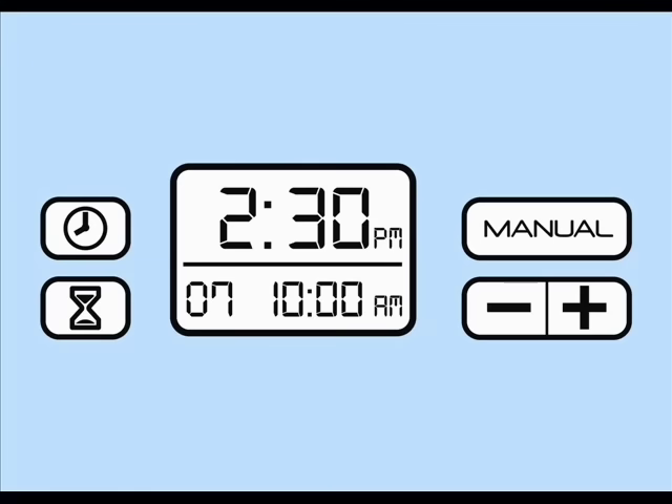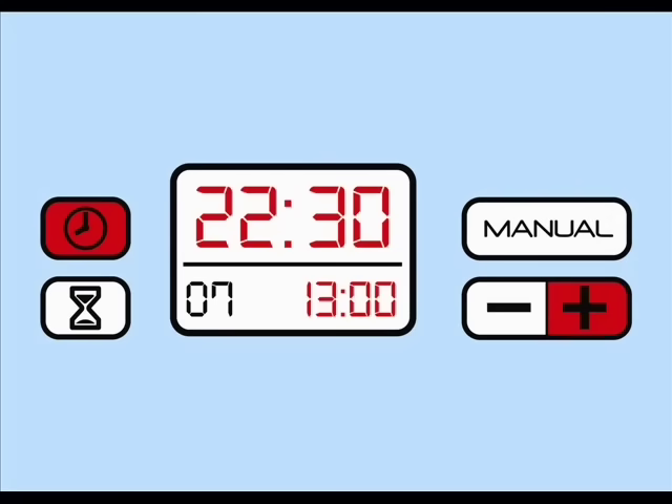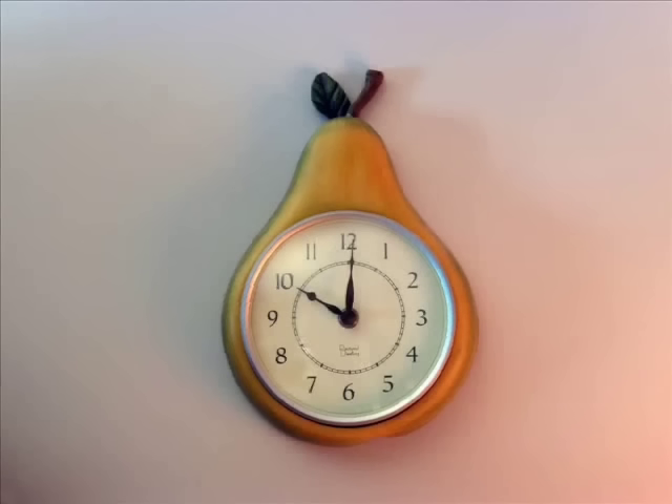If you prefer your clock to display in the 24-hour military time format, press the plus and clock buttons simultaneously. You will then be prompted to choose either the 12 or 24-hour format. The SoClean comes preset to start a 7-minute cycle at 10 o'clock AM every day.